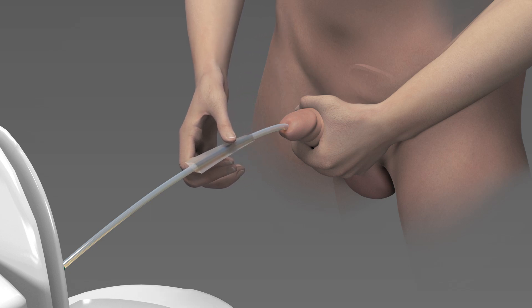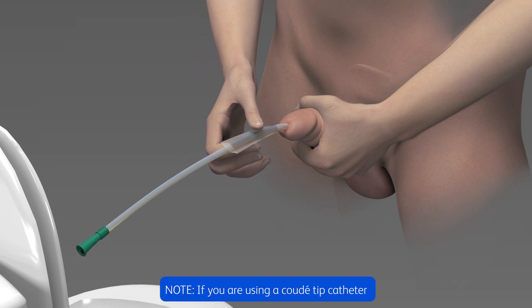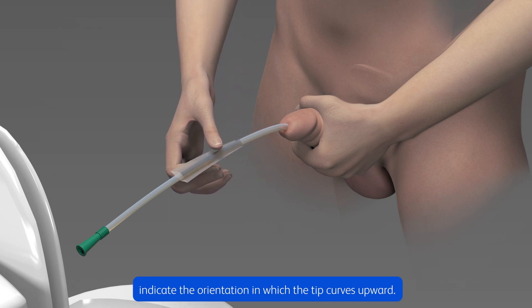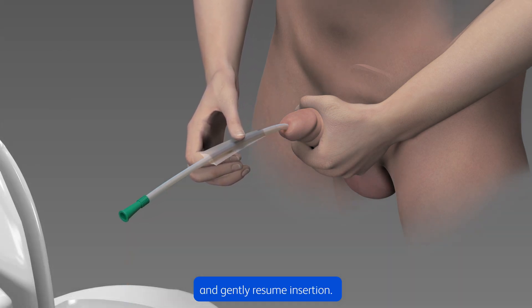Continue inserting the catheter with the insertion sleeve until urine starts to flow. Note: if you're using a coudé tip catheter, the raised notch on the catheter funnel will indicate the orientation in which the tip curves upward. Ensure that the coudé indicator notch is facing upwards during insertion. Remember to try to stay relaxed when inserting your catheter. If you feel any resistance, stop inserting the catheter, take a deep breath, and gently resume insertion.